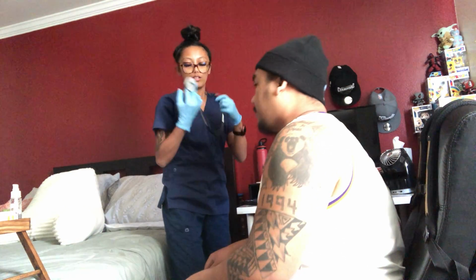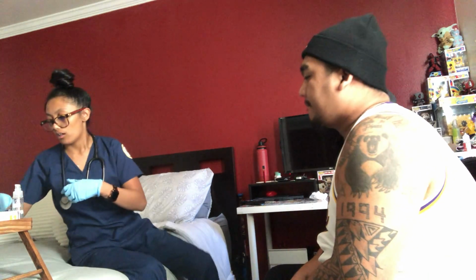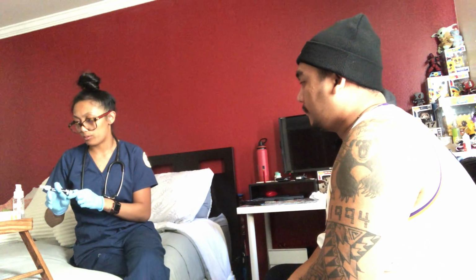So, from listening, I did hear some bilateral wheezing. The medications that I will be showing you how to use today will help with it.